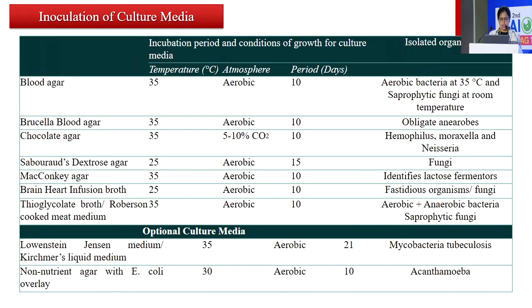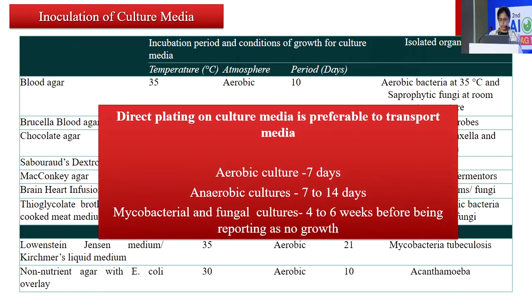So these are the various culture media available for different organisms. Direct plating, of course, is preferable. We tend to bug our microbiology department asking what's the report. Do know that it does take time. Aerobic cultures you have to wait at least 7 days, anaerobic cultures 7 to 14 days, mycobacterial and fungal cultures 4 to 6 weeks before reporting as no growth.